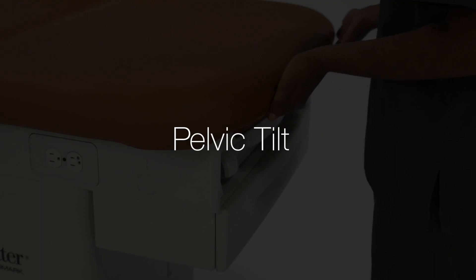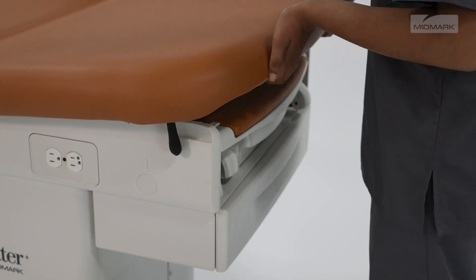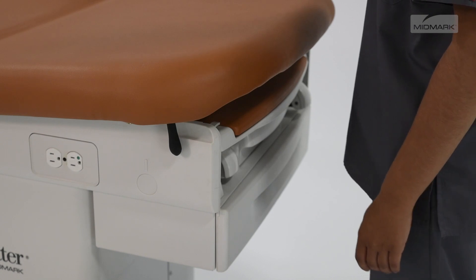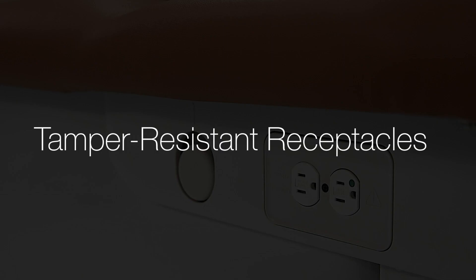To elevate the chair seat section, lift the seat until the pelvic support drops into place. To return the seat section to a flat position, lift the seat section slightly, pivot the pelvic support handle upward, and lower the seat section.